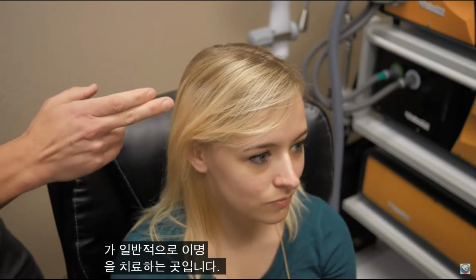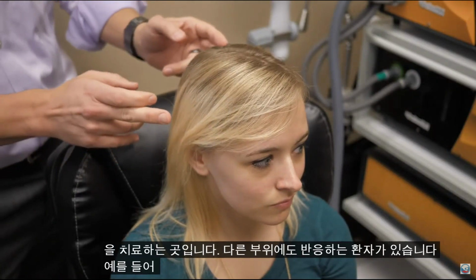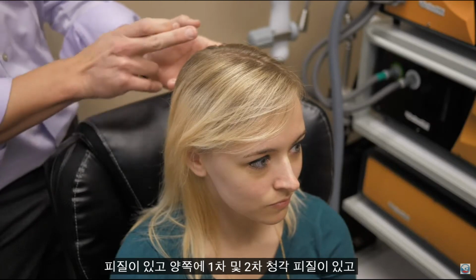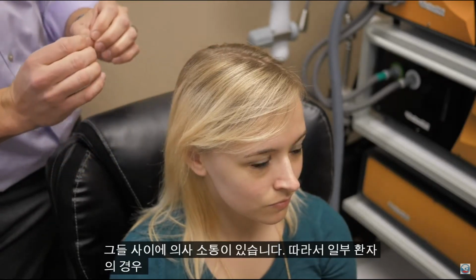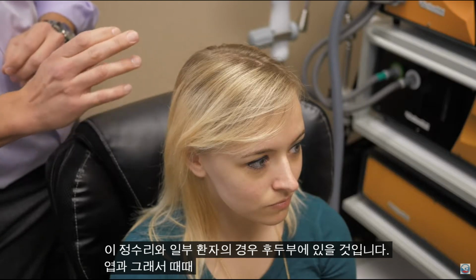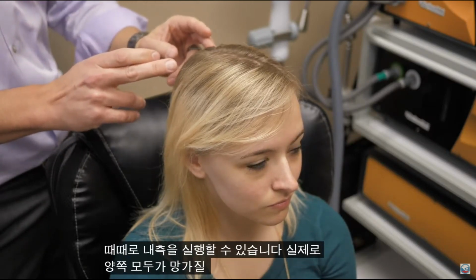There are patients that will also respond to other regions. For example, each side you have the auditory cortex, the primary and secondary on each side, and there's a communication that runs between them. And so for some patients, the focus of the tinnitus will be here in the parietal, and for some even in the occipital lobe. And so sometimes you can run medial, at times we'll actually run bilateral on each side.